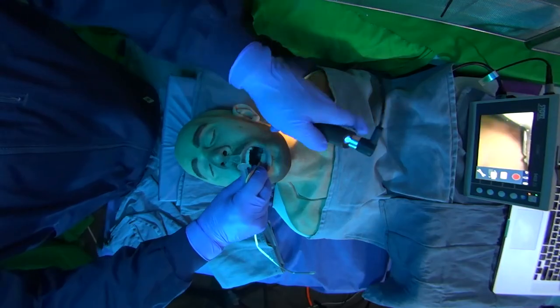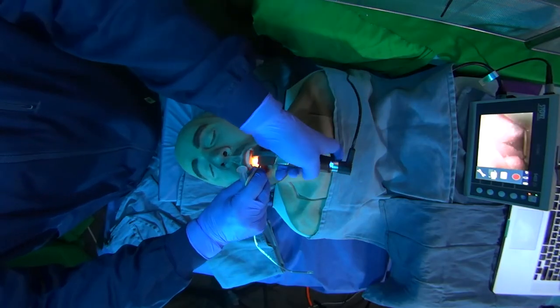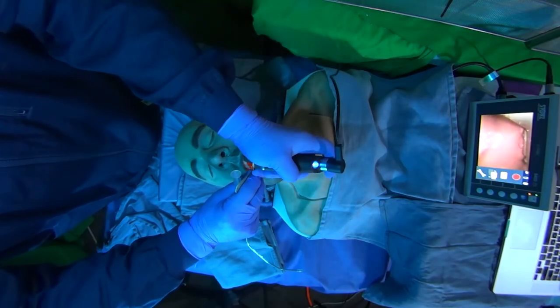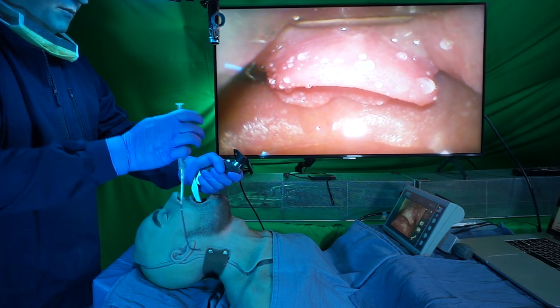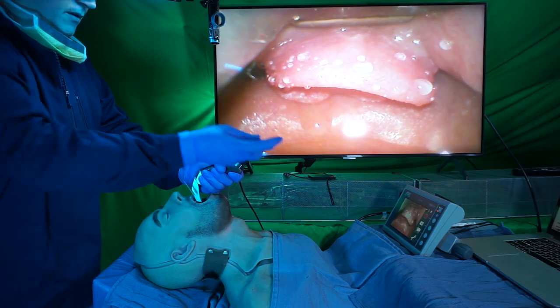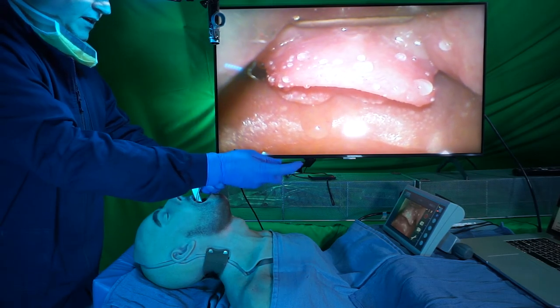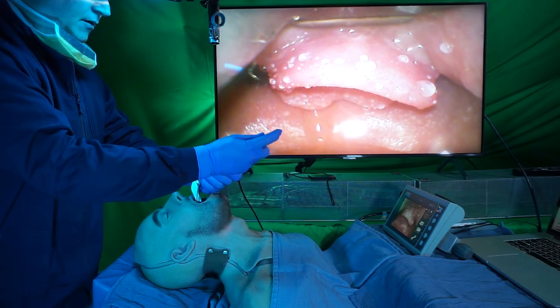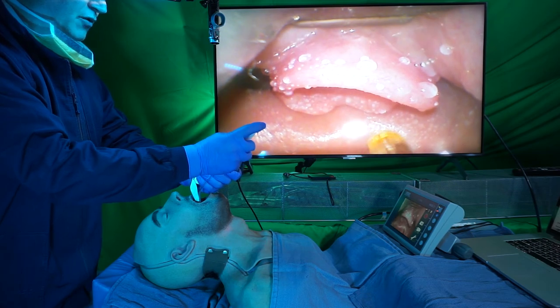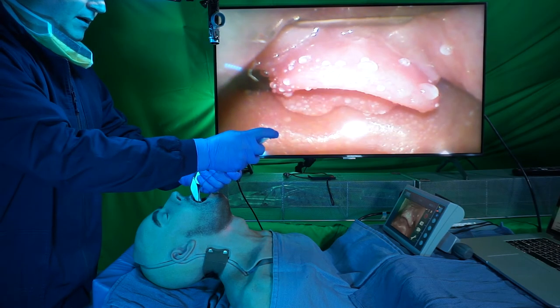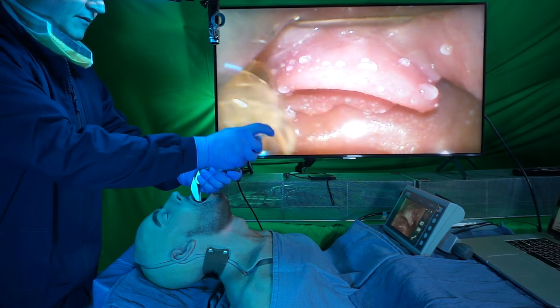Insert the laryngoscope and visualize the glottic opening. Slide the DART Reach along the laryngoscope and directly target the glottis, vocal cords, and beyond with additional anesthetic spray.